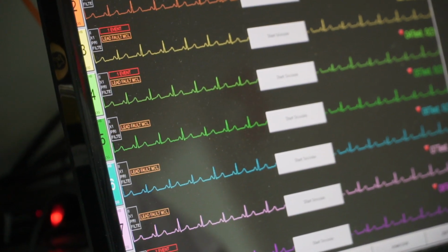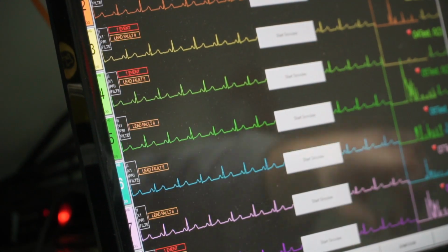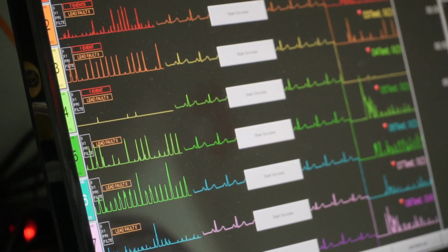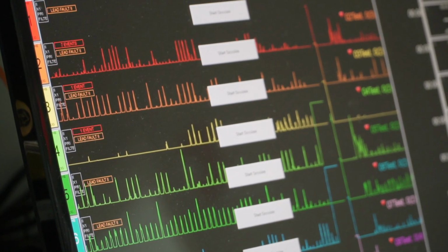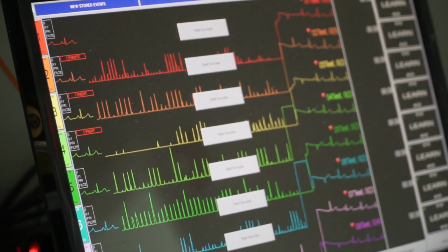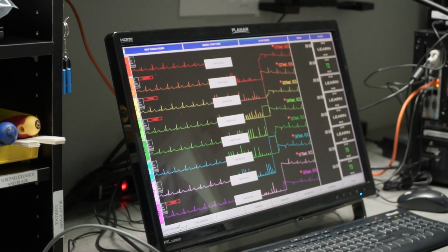If we disconnect the white lead, the lead 2, you'll notice our signal just totally evaporates or goes kind of nutty, but we also have a lead fault 2 now. And once we correct these, we'll see a normal heart rhythm come back, and the leads are good. There's no errors.